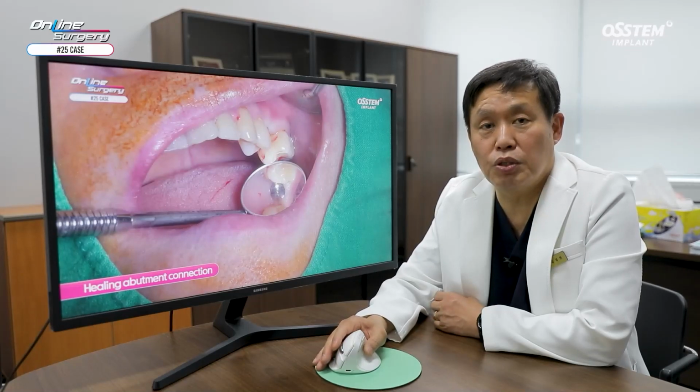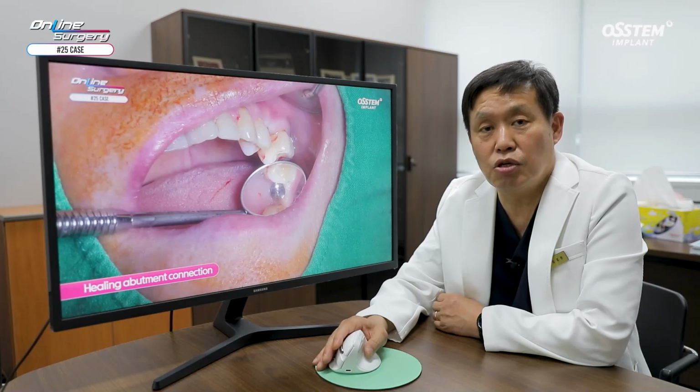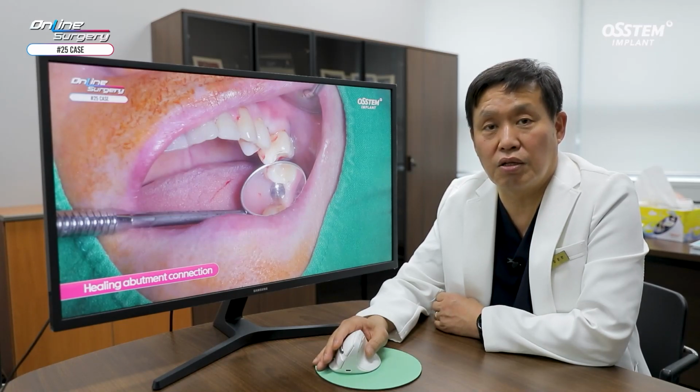Socket preservation using A Oss was done previously on the palatal side. If you look at the CT before surgery, there's a bit of resorption, but actually the implant has been placed deeply, so there were no major issues.